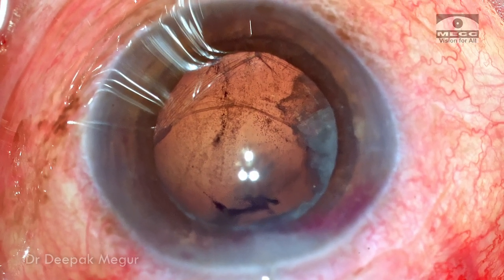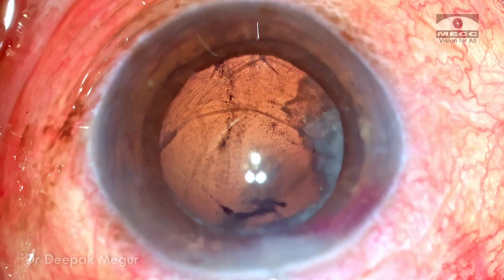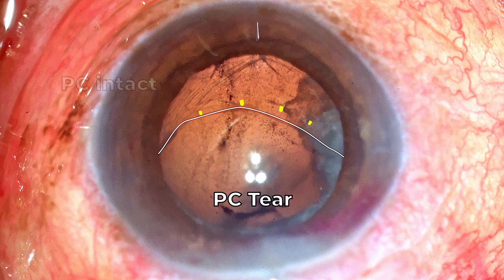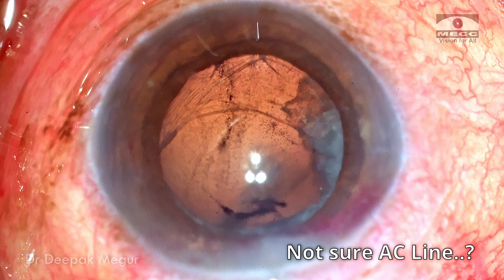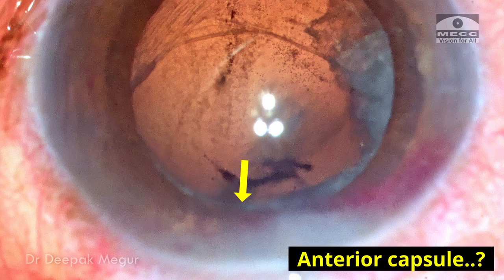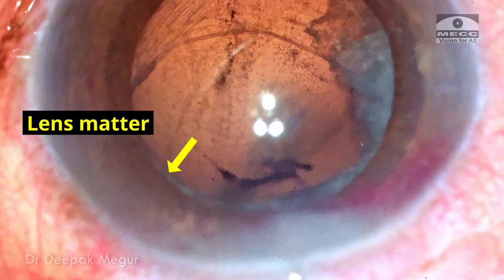This is the view with the retro-illumination mode on the microscope. This is the edge of the posterior capsule and this is where the posterior capsule tear is. We have the posterior capsule beyond this area. There is no capsule support in this area, and I'm not sure where the anterior capsule or the other edge of the posterior capsule is, but this rim in the superior quadrant looks to be that of the anterior capsule. Underneath it there seems to be lens matter which is sequestered inside.